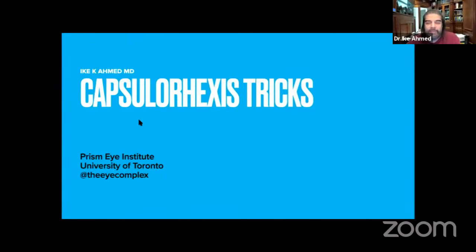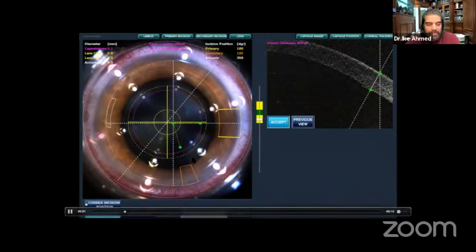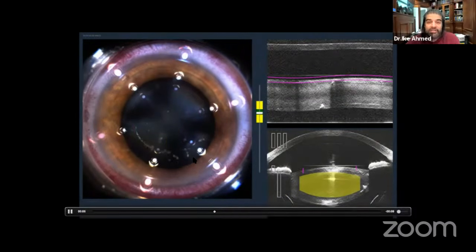So these are my presentation slides here. I will talk about capsulorhexis tricks. These are my disclosures. And really my presentation can be long or short. This is a very simple presentation. I can basically just present this video, which is femtolaser capsulotomy, and then my presentation is over.